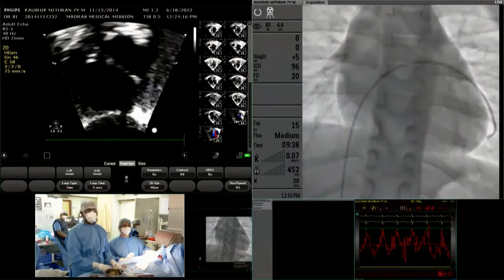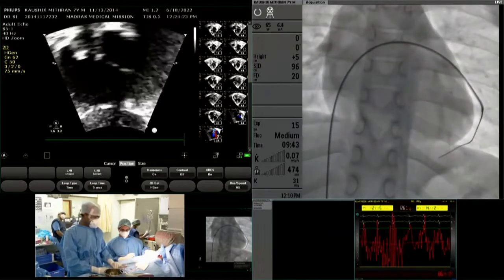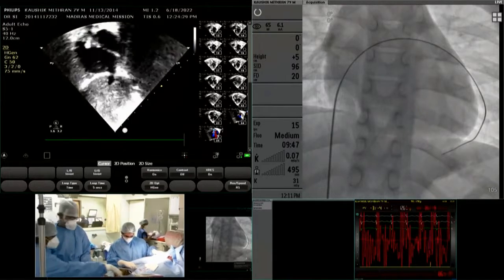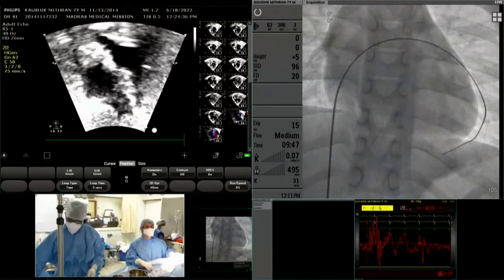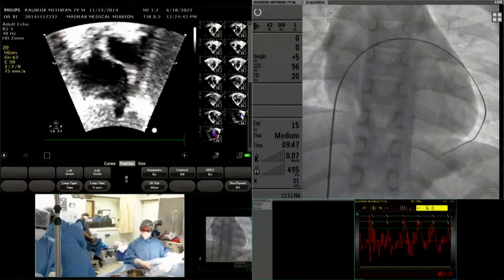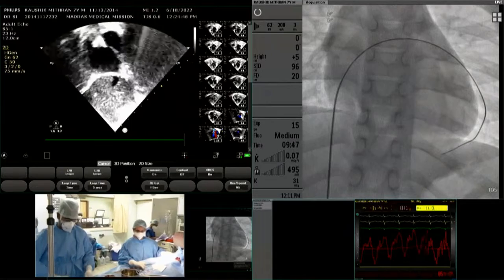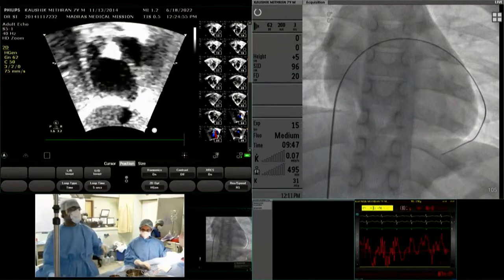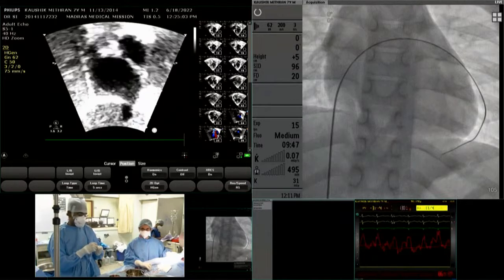Pramod, am I through that? Yes, sir. I'm looking into it, sir. Now we are actually across this. He demonstrated the subcostal view nicely. He went through another perforation, that's why they are not using TEE. It is fairly okay because you can see the image quality is very good. Earlier we had doubt about it, but upon redoing the echocardiogram, they found it has gone through some other hole. I think this is very good. So now the ASD is clearly shown.